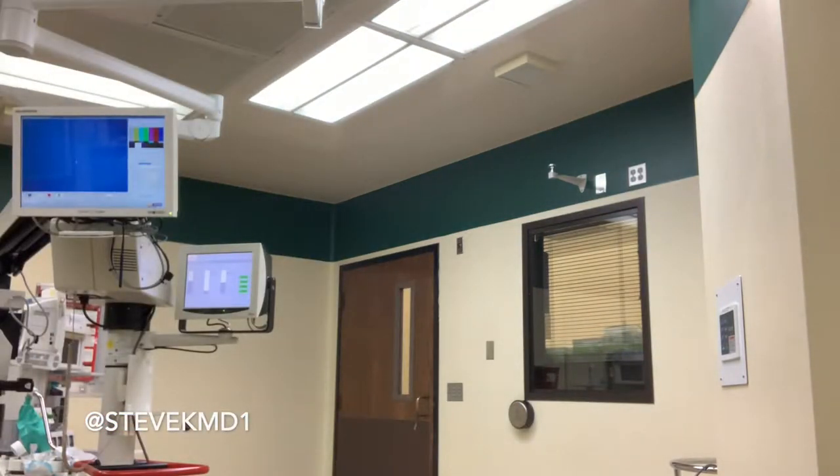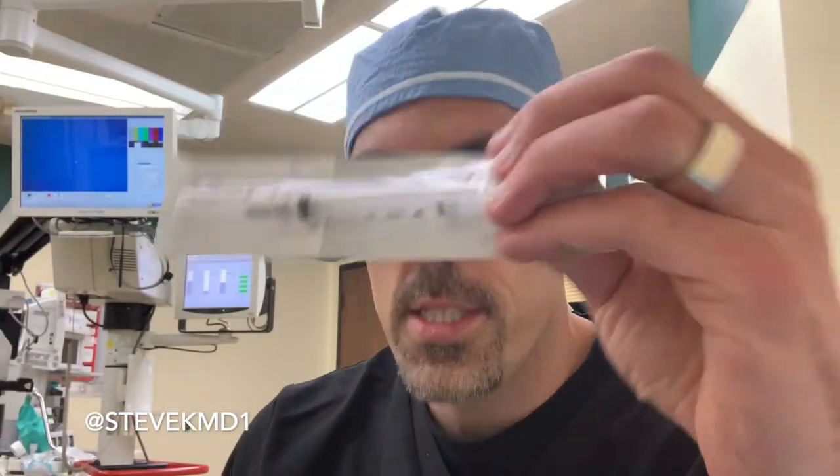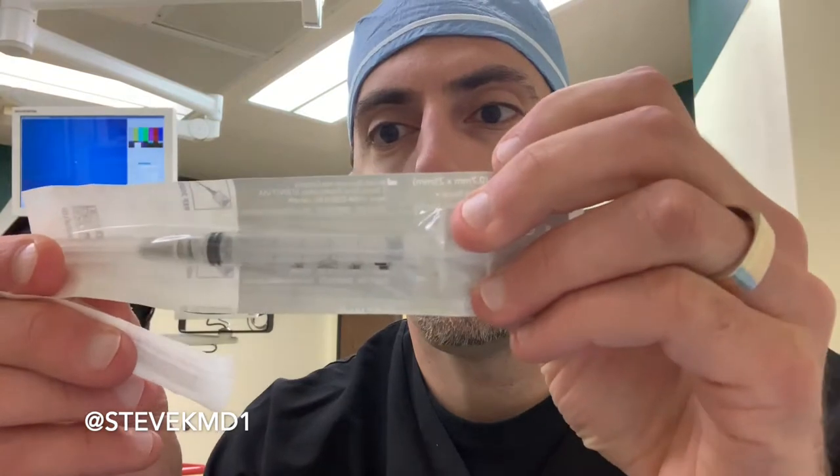Then the very next thing we use is we inject some BSS on a cannula. A cannula looks something like this — you'll have BSS in a syringe, a 3ml syringe — and on the end it's a little tube, like a needle, but blunt. We use that and we inject BSS and we kind of rotate the lens into pieces. Then once we've done that, we use our phaco handpiece, which is a kind of big instrument, and we start to break up the lens.